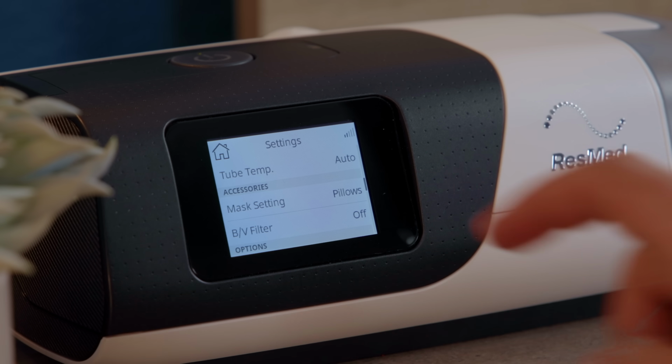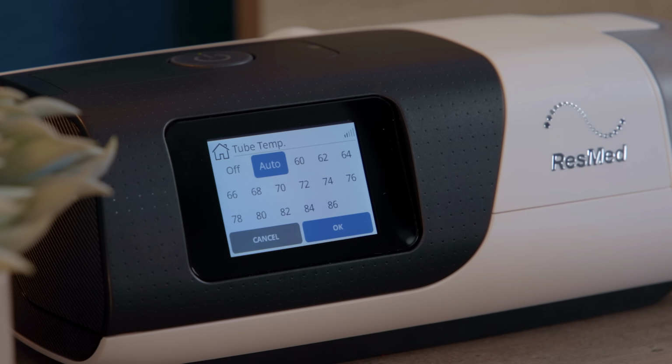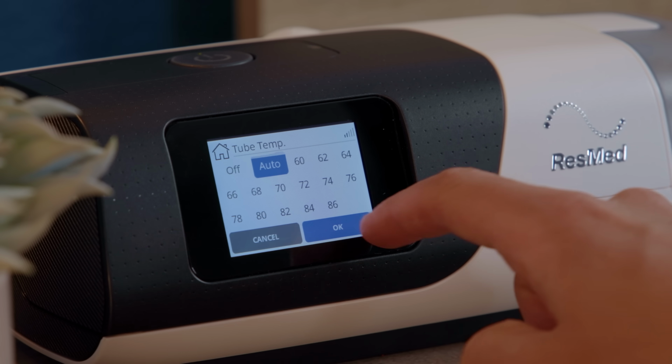Tube temperature works as you would expect. It controls the temperature of the tube and therefore controls the temperature of the air that you're breathing. The temperature is primarily a comfort feature. Breathing in cold air is less pleasant than warm air, and it's easier for your lungs to extract oxygen from warm air as well. Again, I suggest setting this to auto to begin with. Later, if you want, you can manually set the tube temperature or humidity levels if you find that the automatic algorithm isn't working for you.